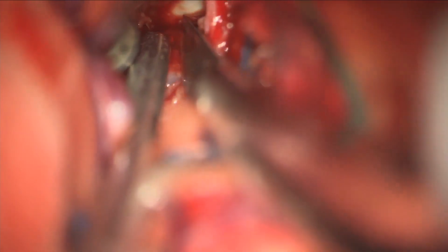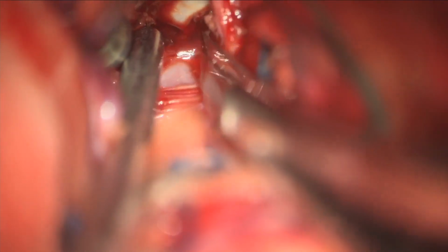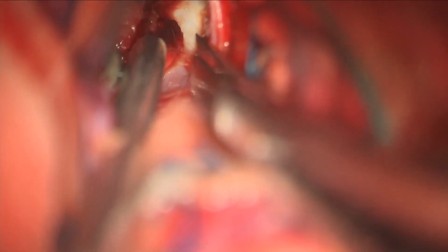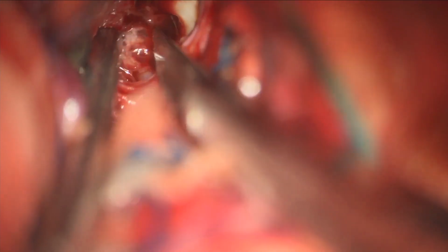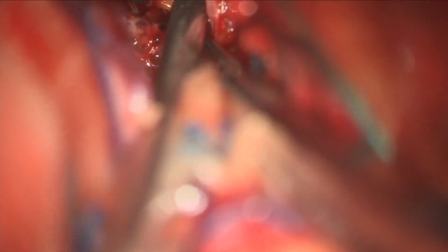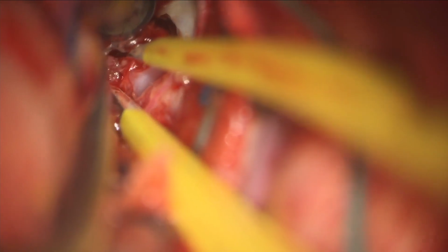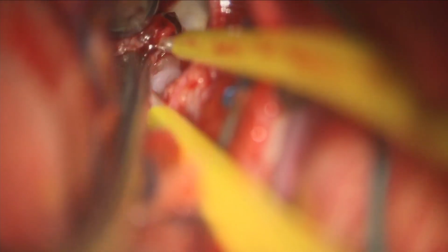Here we're gently dissecting in order to expose more of the aneurysm. And here we're dissecting to visualize the connection between the basilar apex and the P1. See a perforator at the base of the aneurysm there.